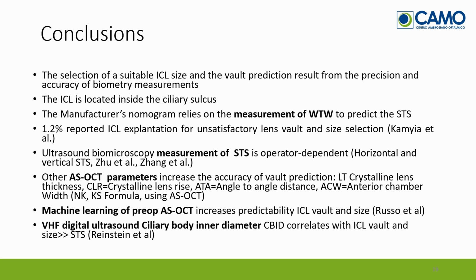Russo has described machine learning from preoperative anterior segment OCT, and again, this has shown an increased predictability of ICL vault and size. And finally, Reinstein has described the use of high-frequency digital ultrasound, measuring the ciliary body inner diameter and offering a very high correlation with ICL vault postoperatively.